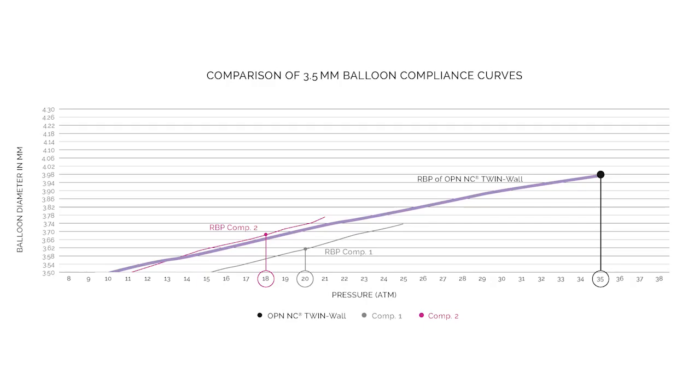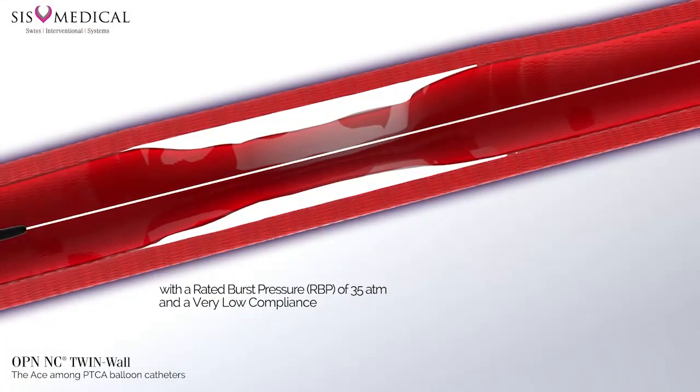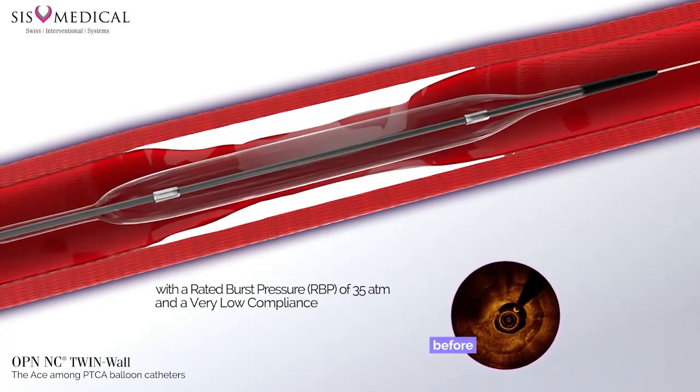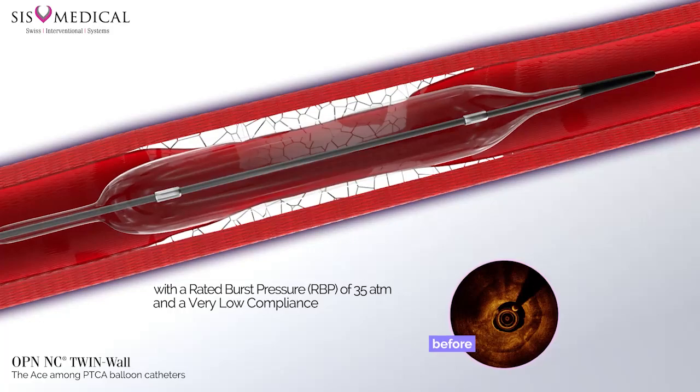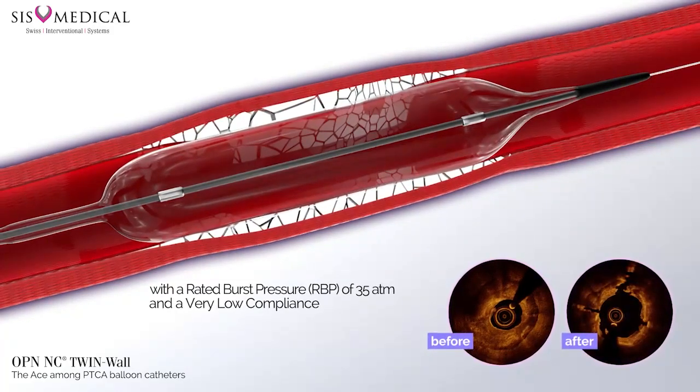And as I have said many times, and I believe this is really an important message for all, vessels are ruptured by diameter, not by pressure. So in my opinion, one should use a OPN NC balloon, because this is the only balloon where you can go to relatively high pressure without really risking the vessel to be ruptured, because your diameter will not increase exponentially.